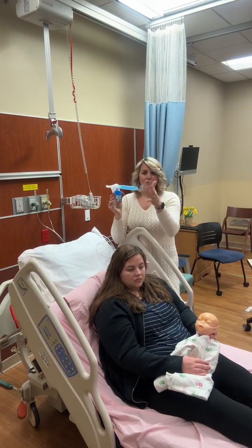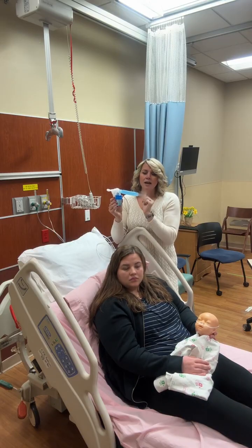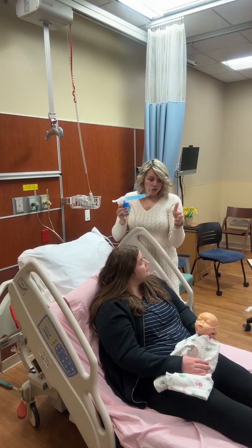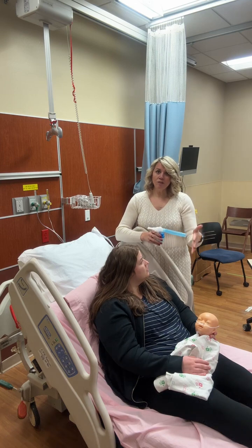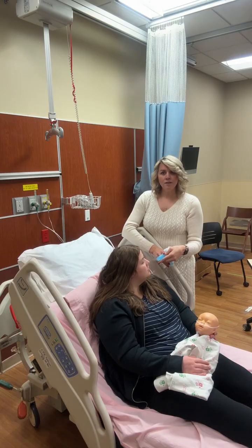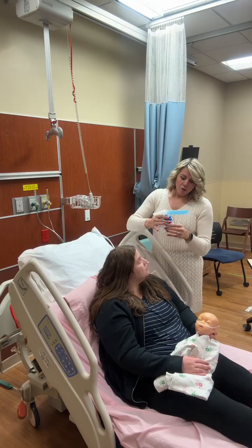So we've sort of taught our children that if you see smoke, it could be hot, and they're going to think that's hot. So they may be afraid of it. So something I usually do with parents is I'll say, all right, Susie, this is not hurt, it's not hot, it's cold, you want to put your hand here, look, it doesn't hurt. And so then I might say, look, Mom is going to breathe in a little bit, and no owies, it doesn't hurt.